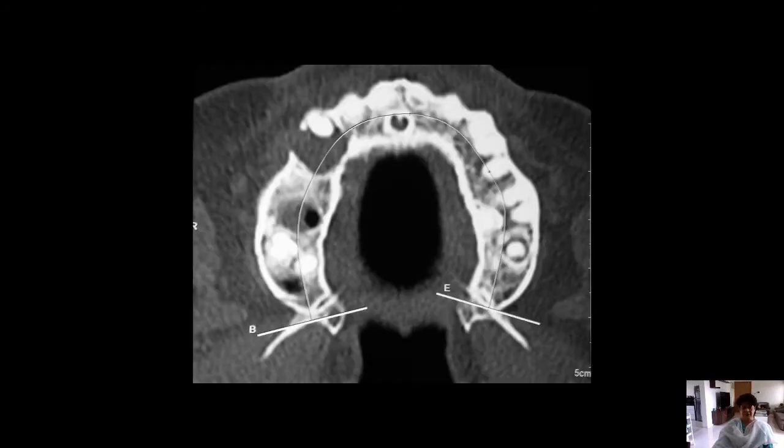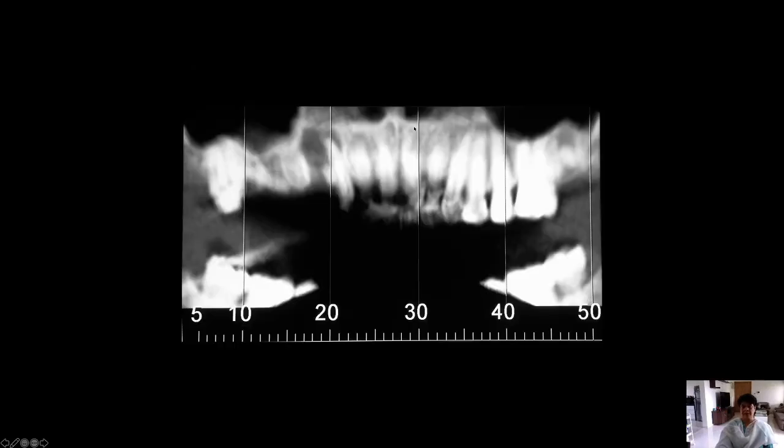After the soft tissue was healed, the patient was brought to me and I was supposed to be doing the surgery. So she required sinus surgery. And this was the situation. This is not a CBCT because in 2006 we used to use DentaScan, which was done on a CT scan machine. And the axial section of this DentaScan image shows you that the canine which he had retreated looks fine, but there is a huge granuloma around it.